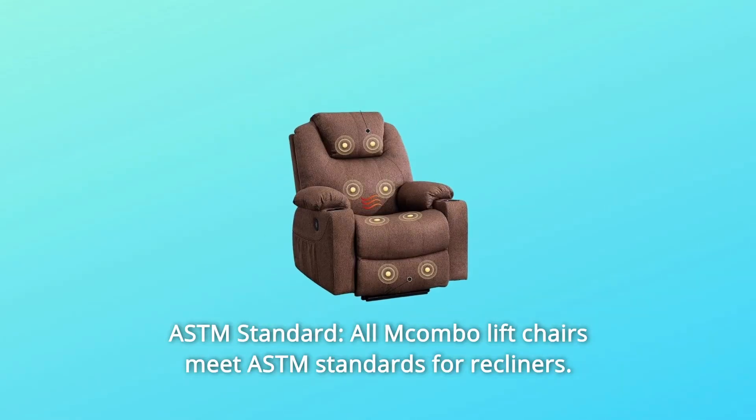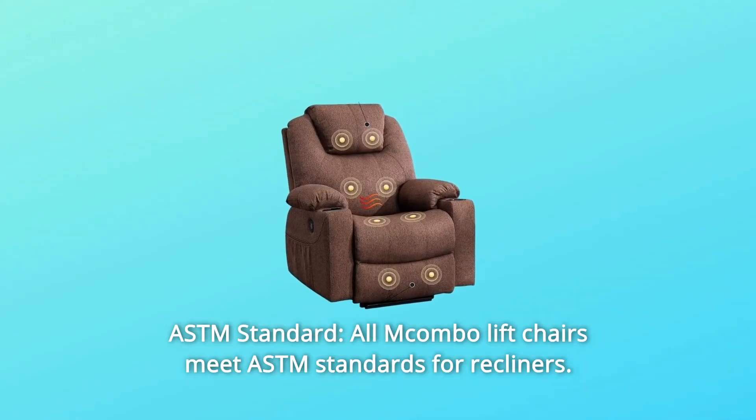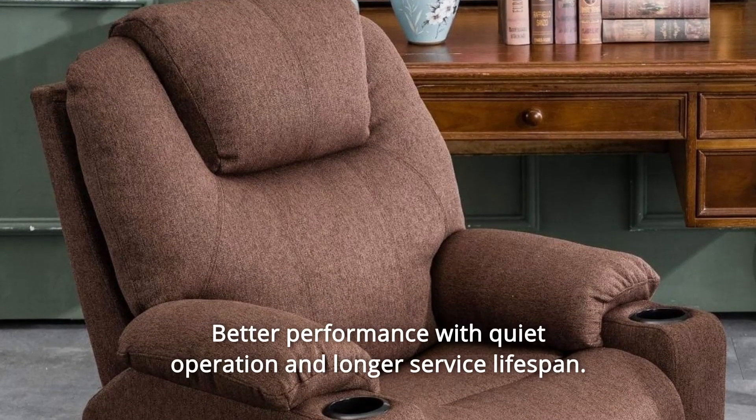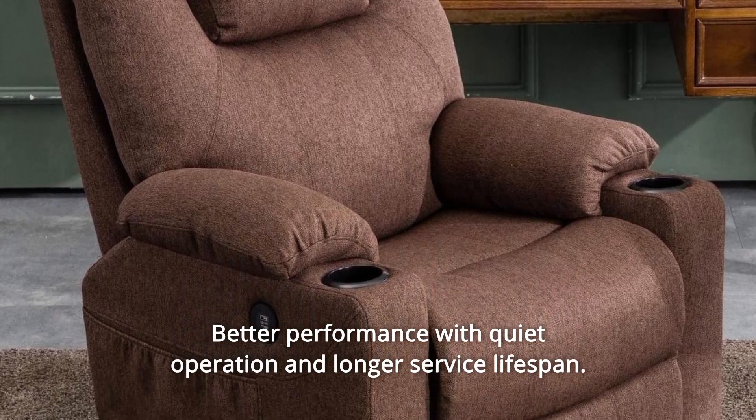Number 1: ASTM Standard. All Mcombo lift chairs meet ASTM standards for recliners, with better performance, quiet operation, and a longer service lifespan.